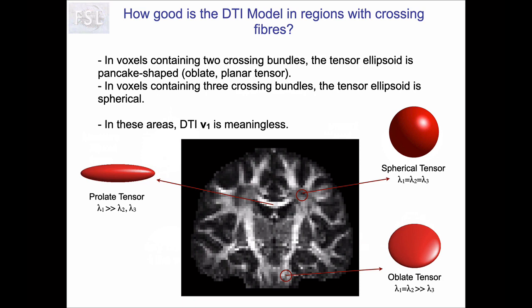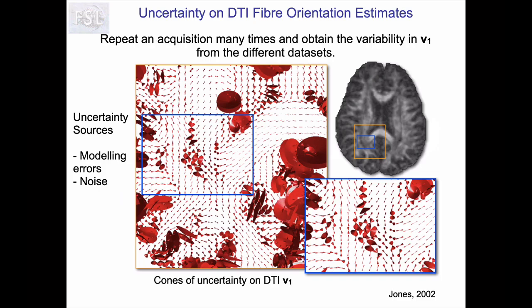And so all of these different diffusion tensors are present in different parts of the brain's white matter. For example, in the corpus callosum, connecting the left and the right hemisphere, we tend to have this preferred direction of diffusion from left to right with this clear cigar-shaped prolate tensor, while in other parts of the brain we've got crossing fibers leading to oblate or even spherical tensors.